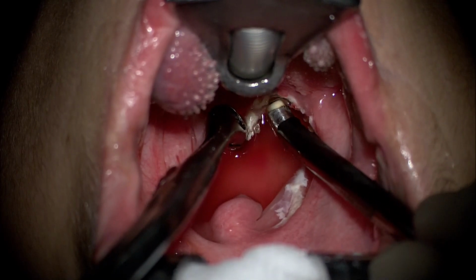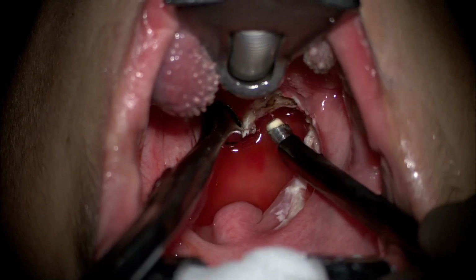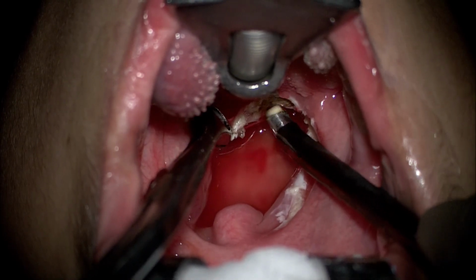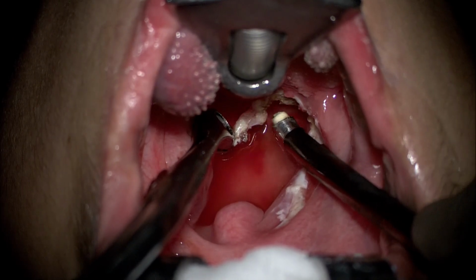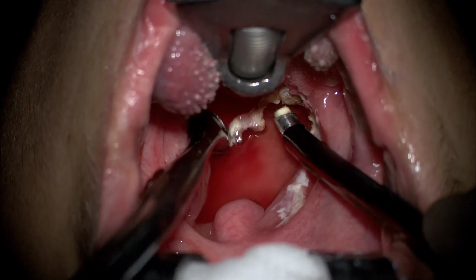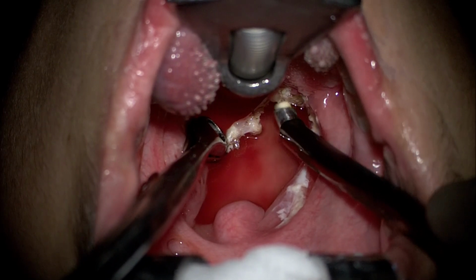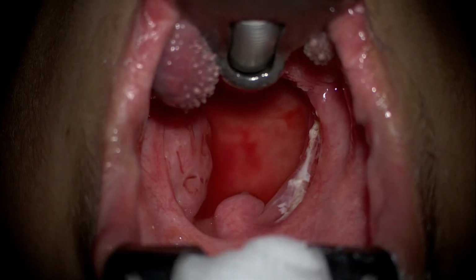And as we keep medial traction on the tongue of remnant tonsillar tissue, the same coblation device can very easily and elegantly remove this excess tissue. This could have been removed by ablating it from the medial surface as well, but since there was sufficient tissue, we could hold it using a forceps and get it out of the fossa.